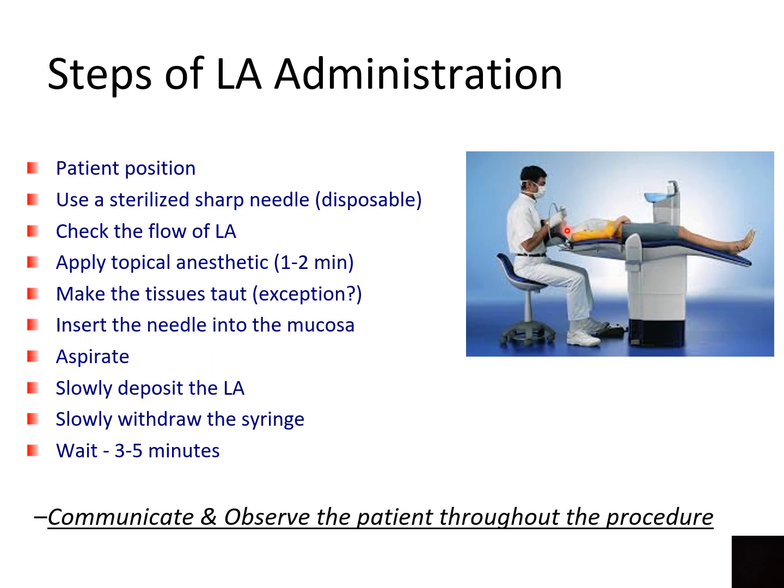And secondly, during your LA administration, ask the patient to wiggle their toes and take deep breaths, and that keeps their circulation going and also distracts them. Also maintain good eye contact with the patient and work out hand gestures so they can stop you should they get uncomfortable. So that's one of the most important ones.